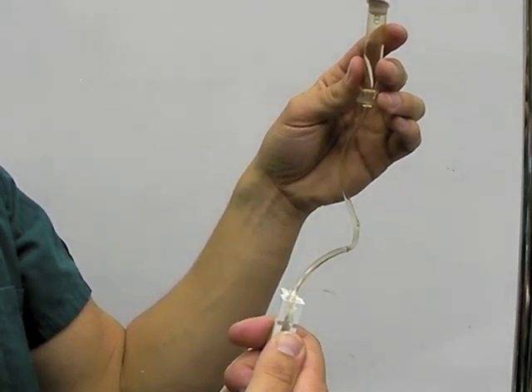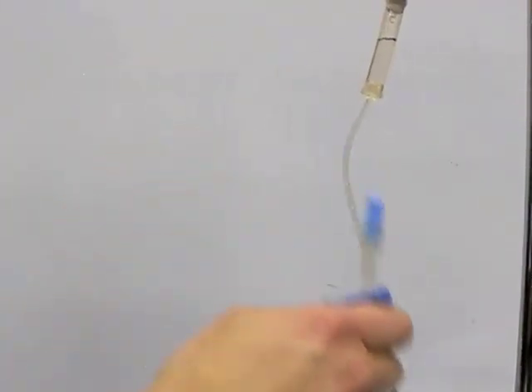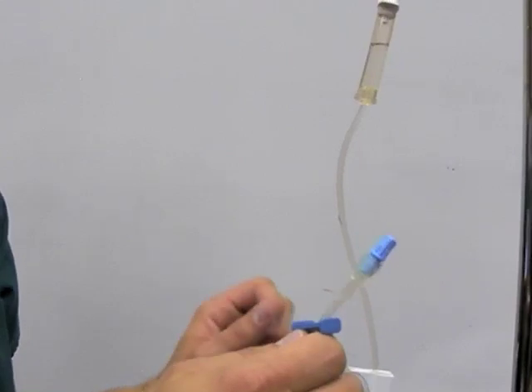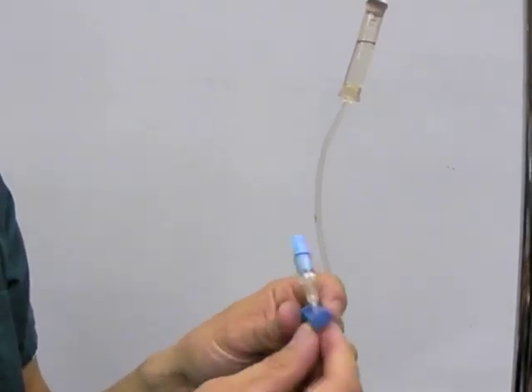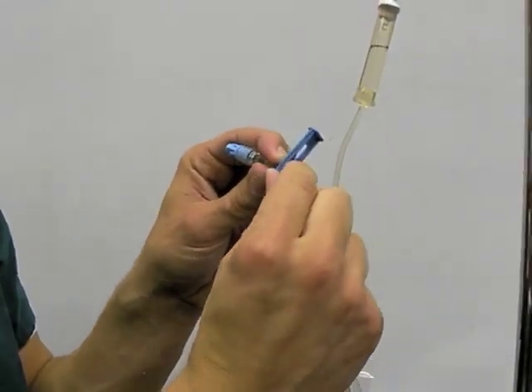If we have a drip rate set and want to occlude the line, we can use a slide clamp. This makes it so we can stop and restart an infusion without having to reset a drip rate. Be sure to manually recheck the drip rate once started again.